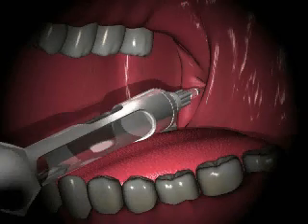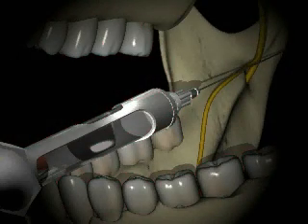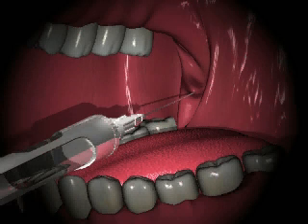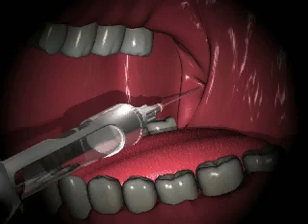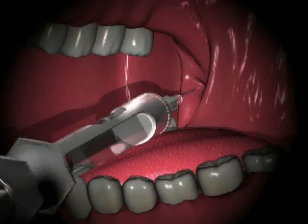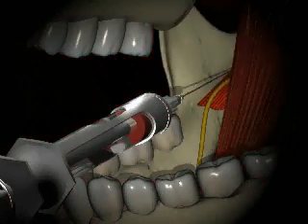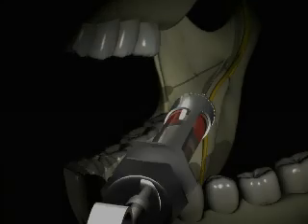If you do not contact bone after 25 millimeters and the needle is almost buried, you should redirect by withdrawing somewhat, but not completely, and move the barrel of the syringe more laterally, and advancing again until bone is contacted. You should repeat this procedure as necessary.